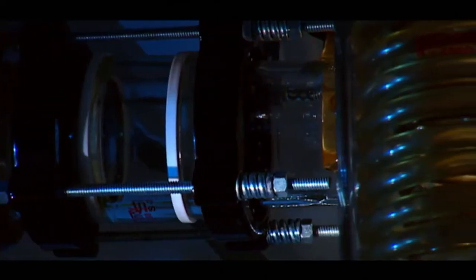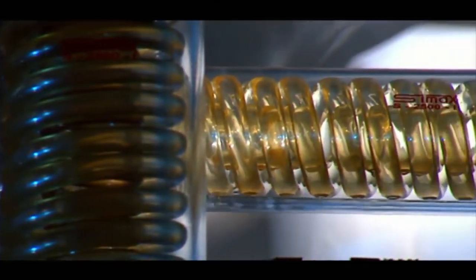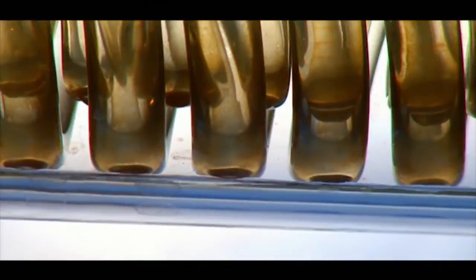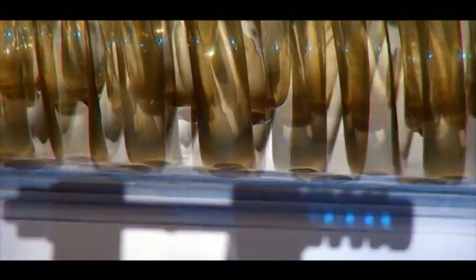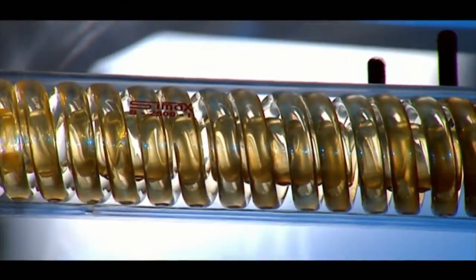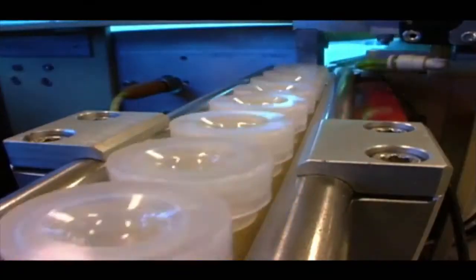At a microscopic level, the acrylic now takes on an extraordinary structure. Its molecules will very quickly join up into long and easily shaped chains called polymers. To provoke this chain reaction, you add heat. Sounds straightforward enough, but there's a catch.